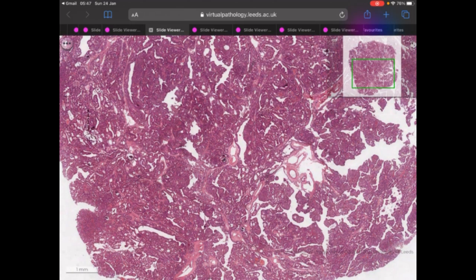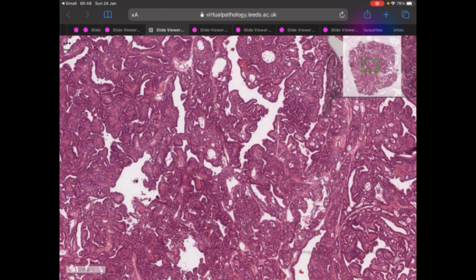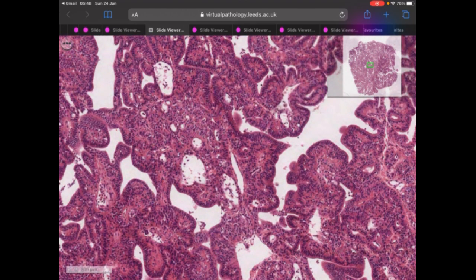This is a choroid plexus papilloma. In this low power, you can all observe that they are composed of fibrovascular cores. They are papillae that branch, and all these papillary structures are lined by cuboidal to columnar neoplastic cells, and these cells exhibit bland nuclear features.